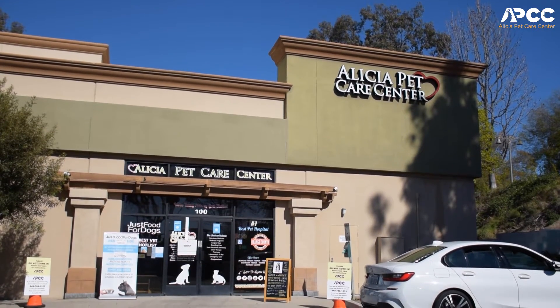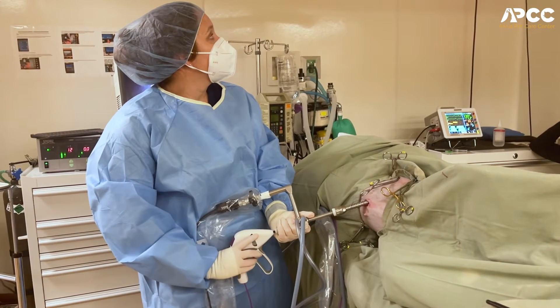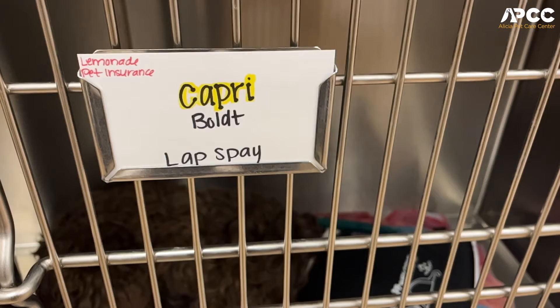My name is Dr. Laura Ashbrand. I am an associate veterinarian at Alicia Petcare Center. I'd say I've done hundreds of lap spays. I've been doing it for about nine to ten years. I love lap spays because I'm also very fast at them now, so it probably takes me about 10 to 15 minutes to do a laparoscopic spay.